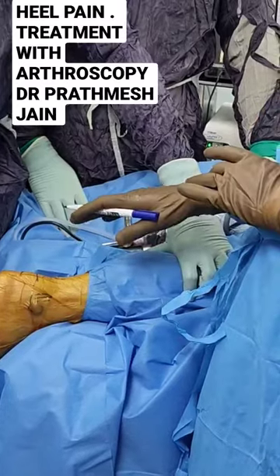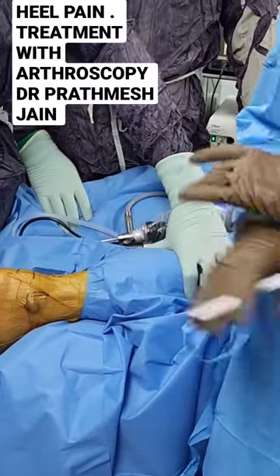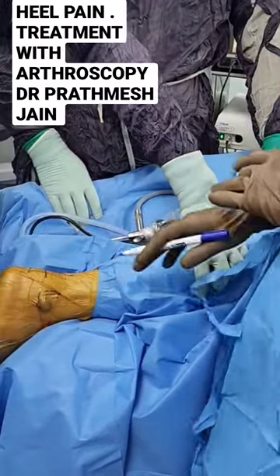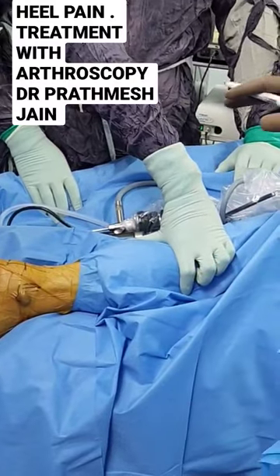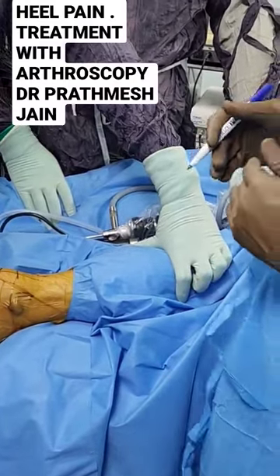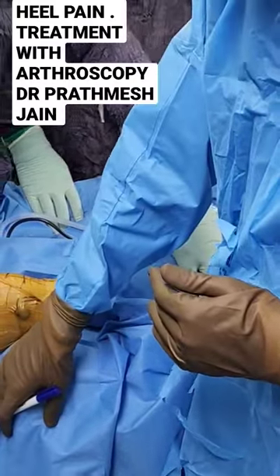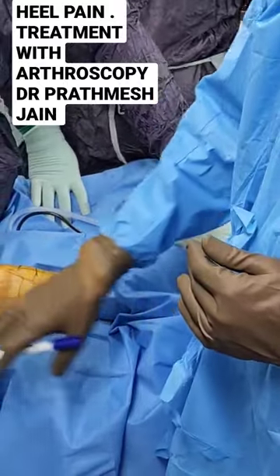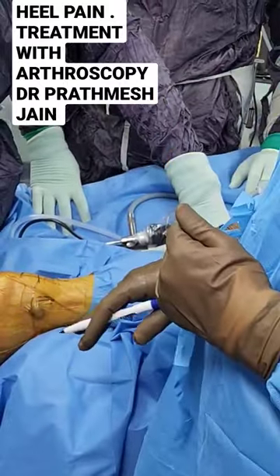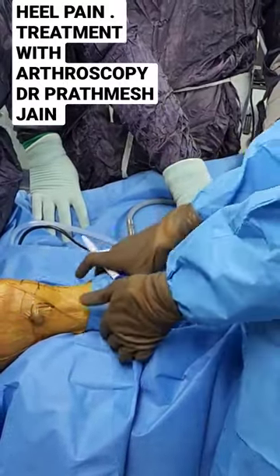We are demonstrating the positioning and the portals for the posterior ankle arthroscopy. The patient is placed prone with the ankle lying free at the last edge of the table so that movement is free.